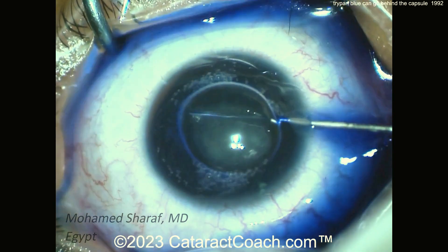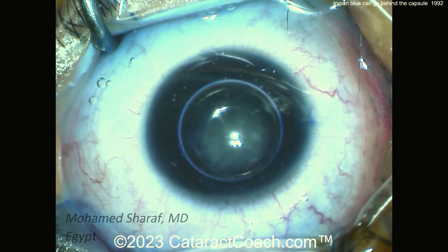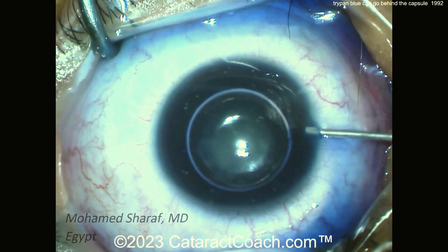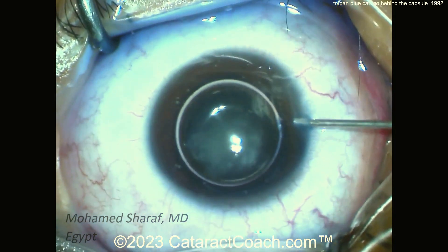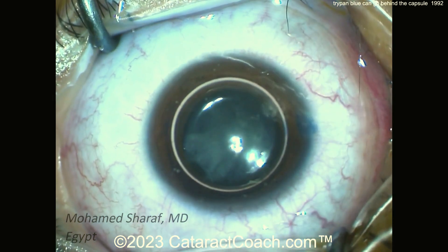In an eye with prior amblyopia, there's an air bubble and just a little bit of trypan blue dye — not a whole lot, so a very conservative amount. You can dilute that down with some BSS or maybe some anesthetic solution. That was a very modest amount of trypan blue dye here.